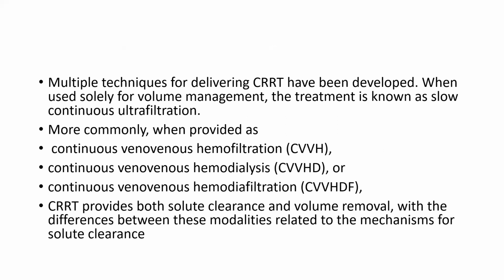Multiple techniques for delivering CRRT have been developed. When used solely for volume management, the treatment is known as slow continuous ultrafiltration. More commonly it is provided as continuous veno-venous hemofiltration, continuous veno-venous hemodialysis, or continuous veno-venous hemodiafiltration. CRRT provides both solute clearance and volume removal, with differences between these modalities related to the mechanism for solute clearance.